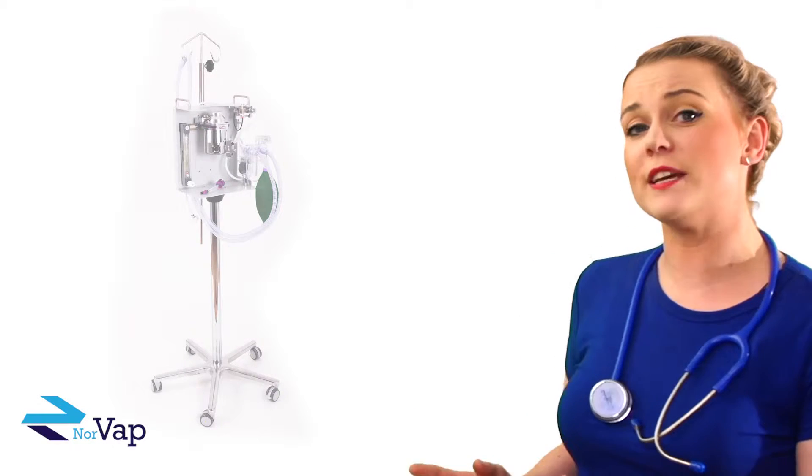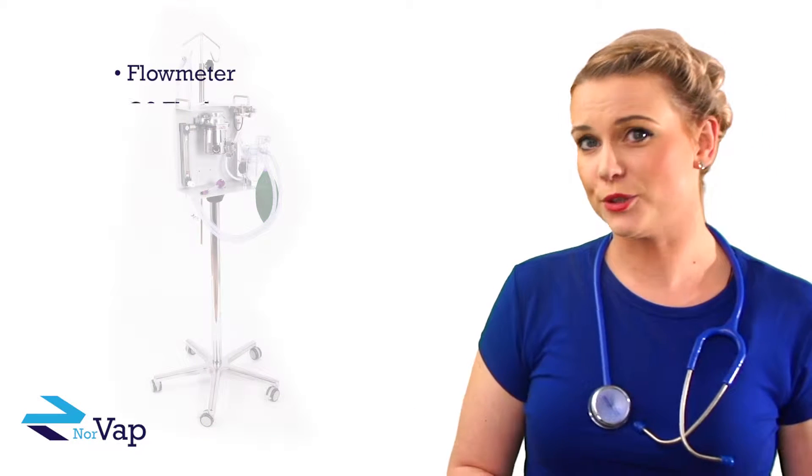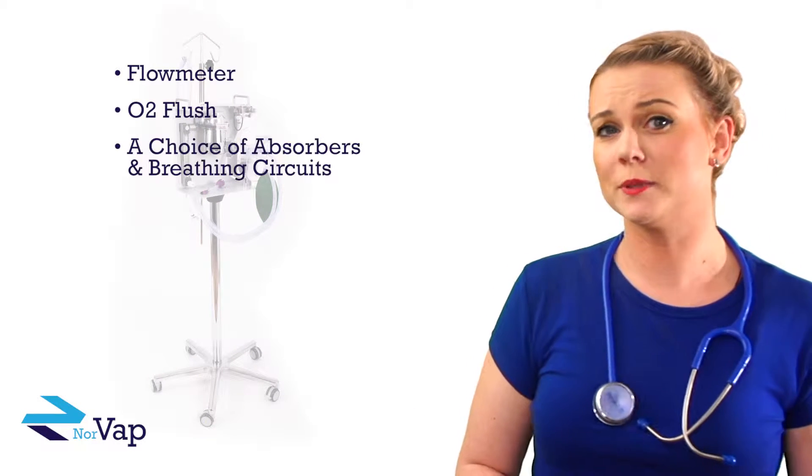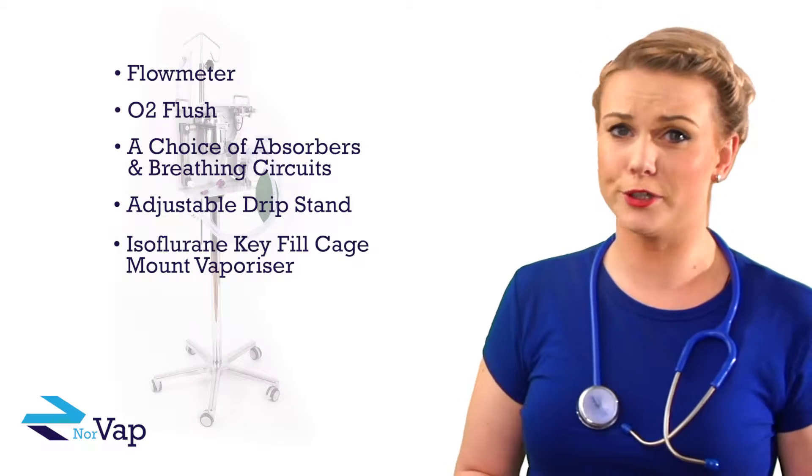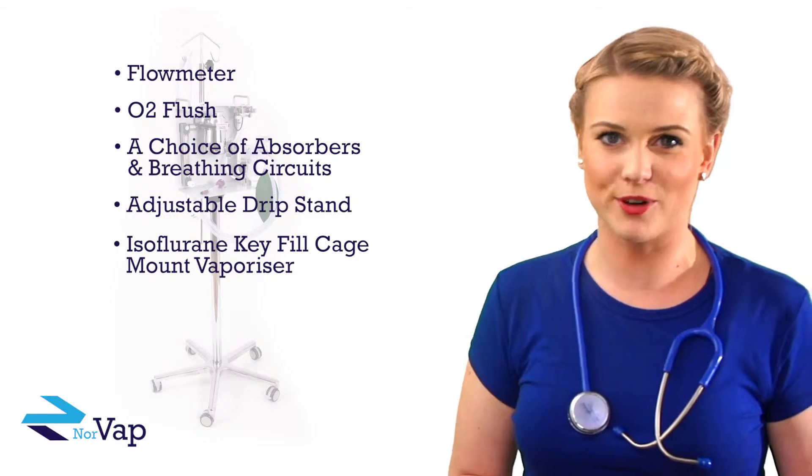This version features a flow meter, O2 flush, a choice of absorbers and breathing circuits, an adjustable drip stand, and comes with an isoflurane key fill cage mount vaporizer.